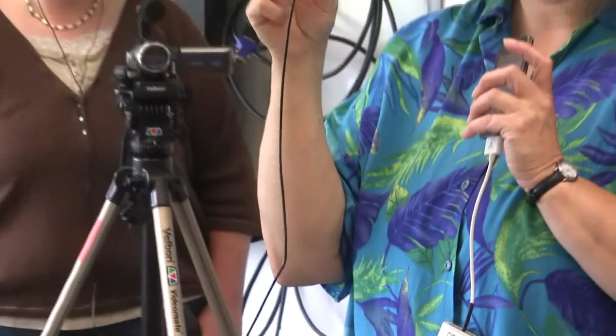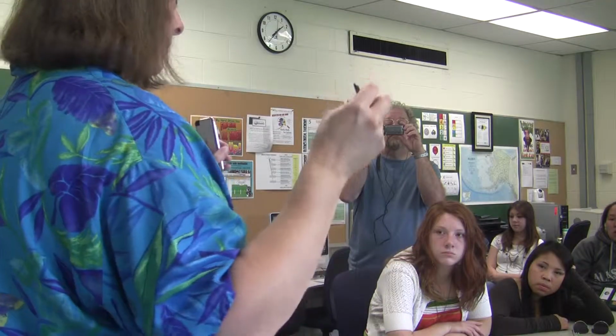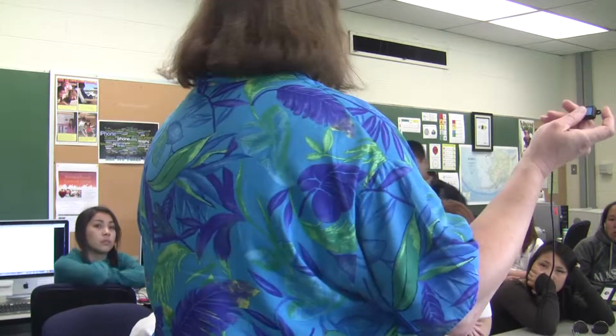And the switch is very, very easy, a light finger touch, and it changes. So you can hook up switches to a lot of different devices, and it's really neat for students that may not have a lot of control to be able to control their own music. How great is that?